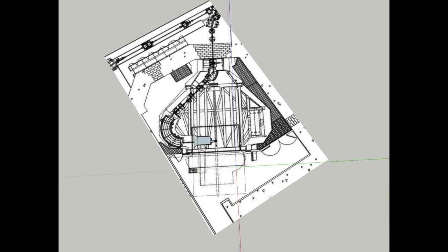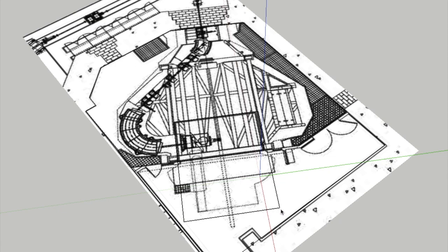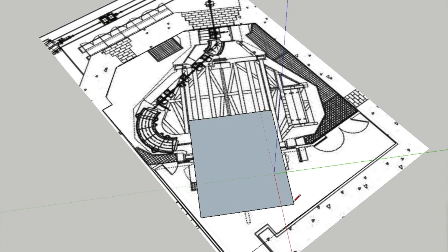What you see there in blue is the beam delivery nozzle that is rotated by the Gantry structure around the isocenter. And if we would model a fixed beam room here, we can say let's install a fixed beam nozzle which is just in the straight path of the beam line, and these two nozzles share the same isocenter for illustration purposes. The area that we need inside the Gantry room is shown here by that rectangle, and we can assume for the sake of the argument that we need the same space for an upright treatment room.